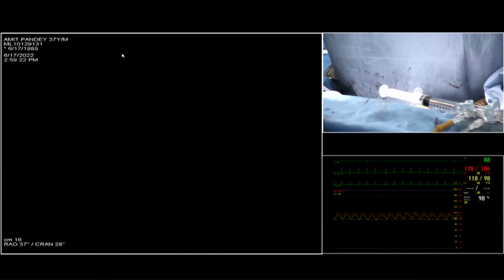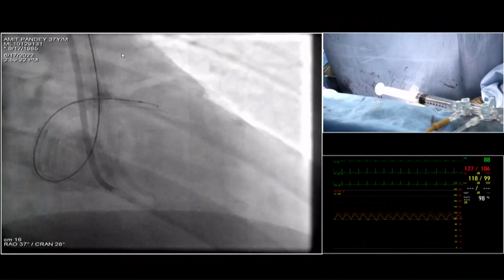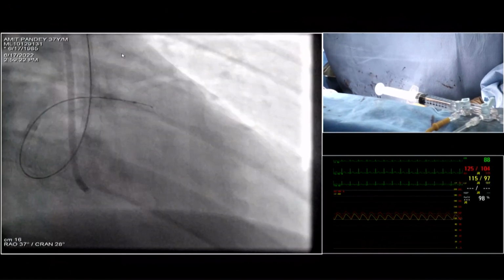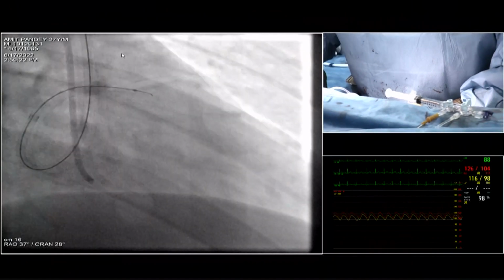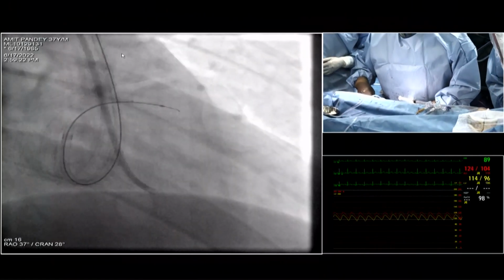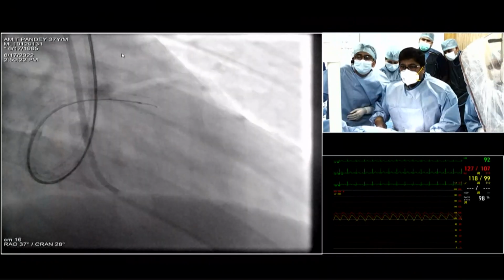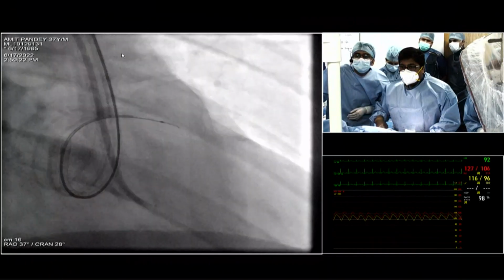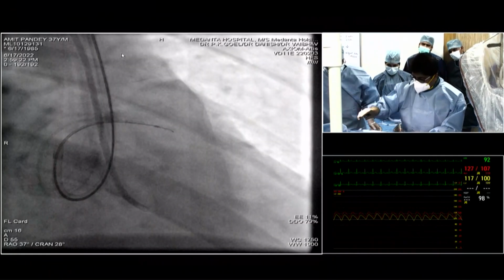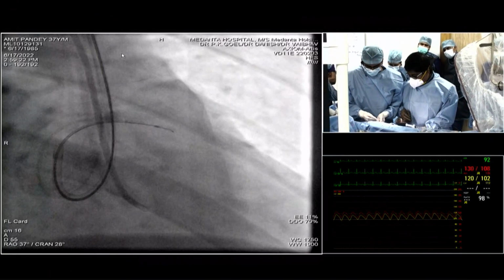What could be the reason the wire is not progressing? Is it lack of support? The first thing is calcium, which is not seen properly in different views, or it is subintimal course. Subintimal is usually a low resistance thing, so once you are there, the wire usually advances better. The first thing that I think he's already done is deep throating the guide or increasing your backup. If you think it's purely a pushability problem, that's what I would start with. So that's one of the reasons why we typically choose a little bit more aggressive guides in CTOs, right?